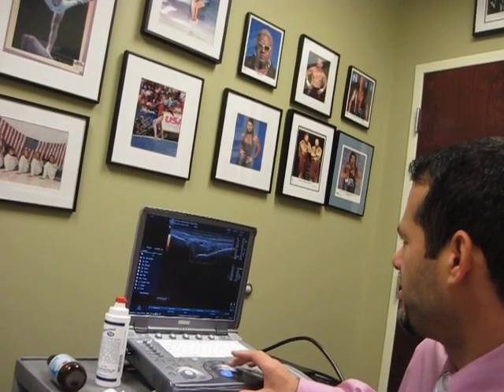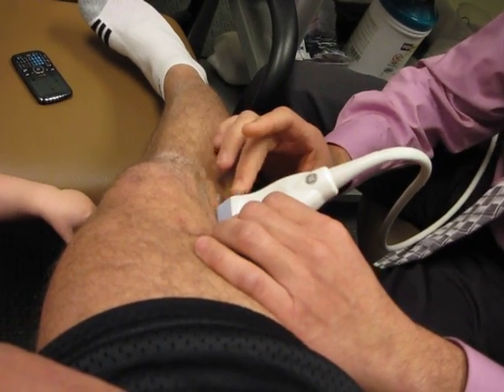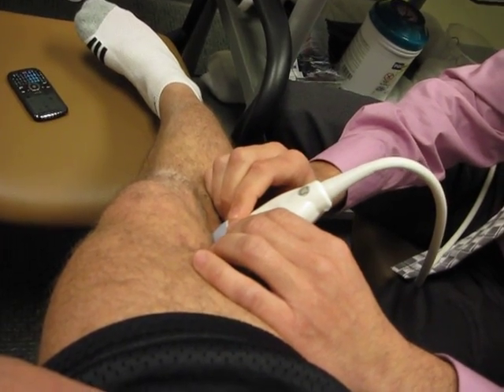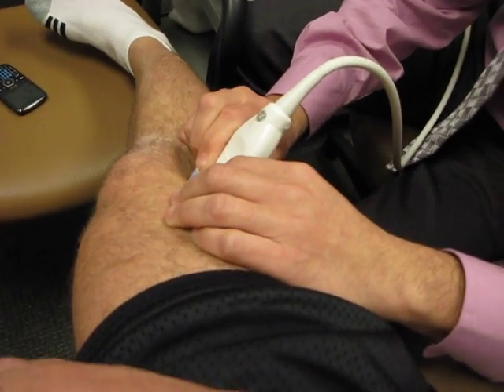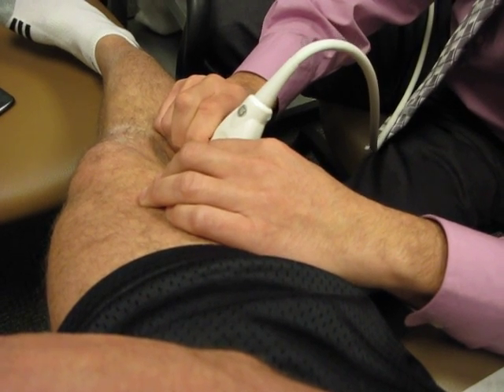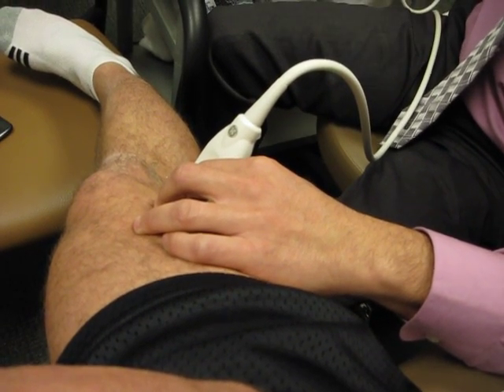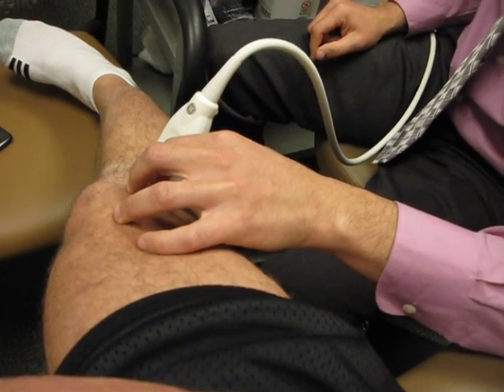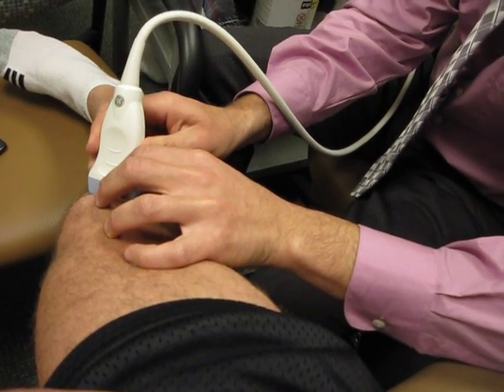That's a blood vessel. It's nothing. So we have this. That's the best way to see it. That is the IT band here. I'm going to follow it over the lateral condyle. And then this is the insertion to the tibia. That's the insertion there.